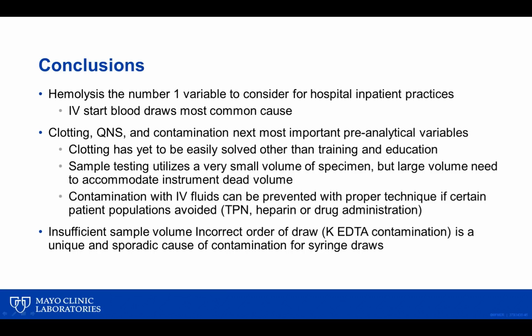And then finally, I reviewed data on potassium EDTA contamination from incorrect order of draw. And the answer seems to be yes, this is possible. It really happens primarily in the inpatient environment where syringes are utilized, but it's really not that much of a problem for the outpatient where a Vacutainer is primarily used.